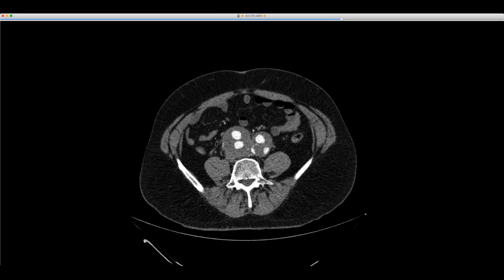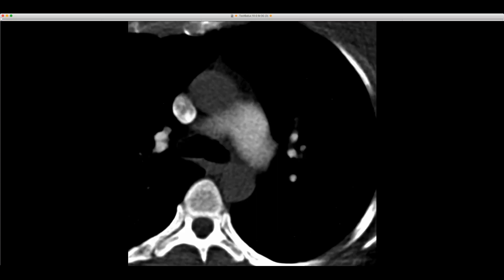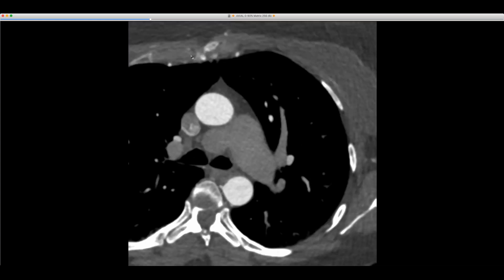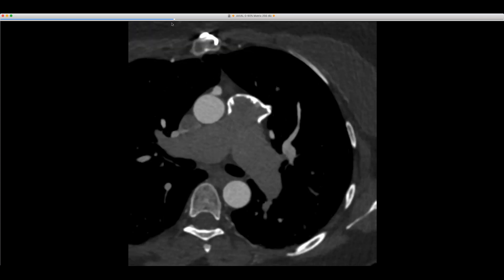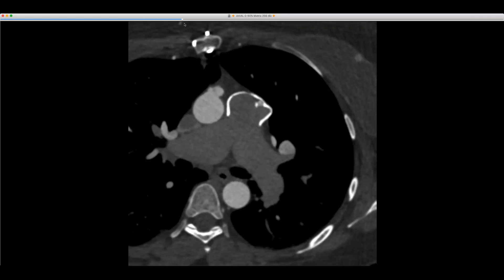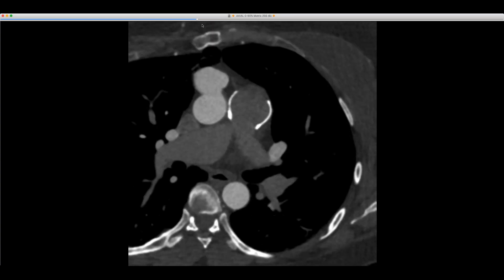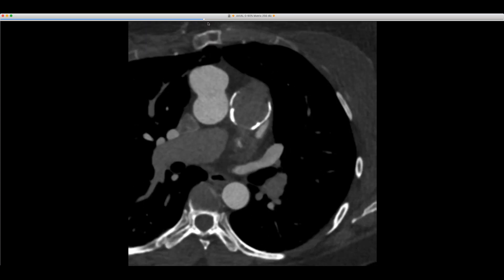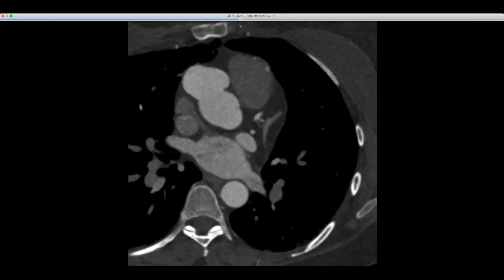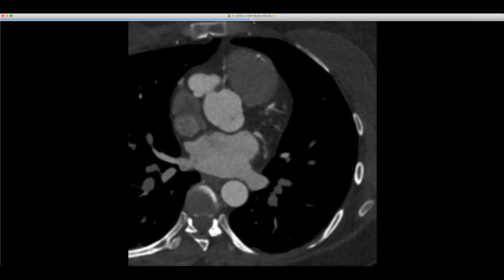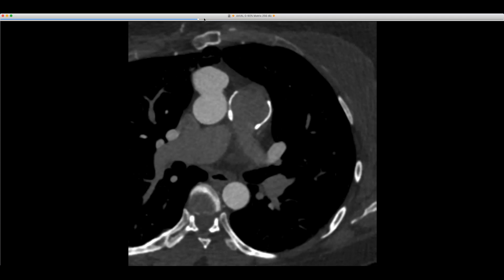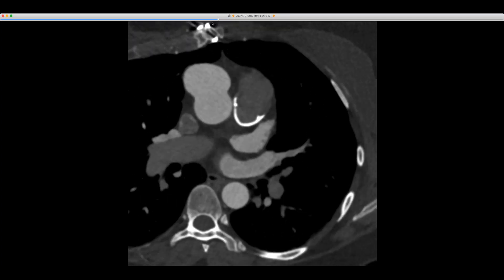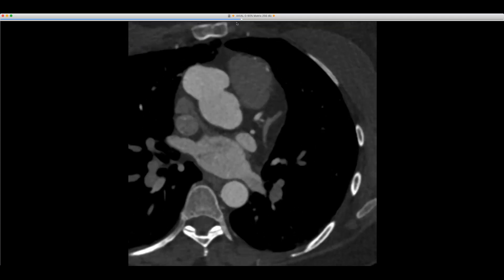Just this last one — one of my favorites. From a scan done for follow-up, this was a tetralogy repair, and you can see part of the patch where they remodeled the outflow of the RVOT. Look at the dramatic pseudoaneurysm of the anterior ascending aorta — and there's another one there. So two cannulation site pseudoaneurysms, as you'd expect for placement of the arterial cannula and the cardioplegia cannula in the ascending aorta.